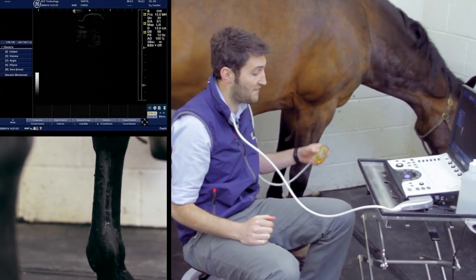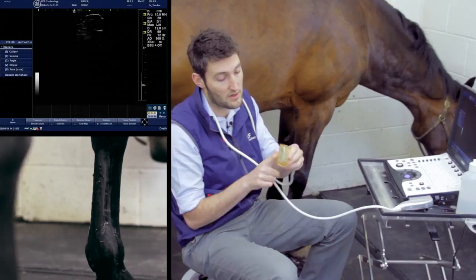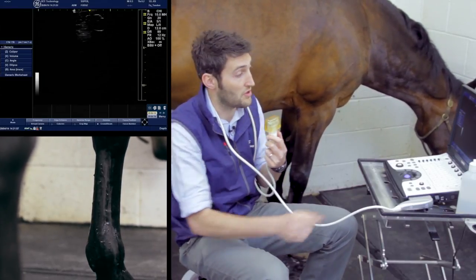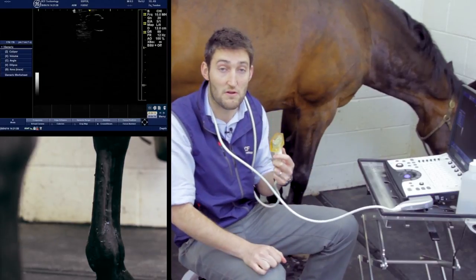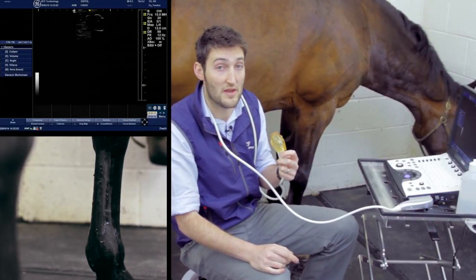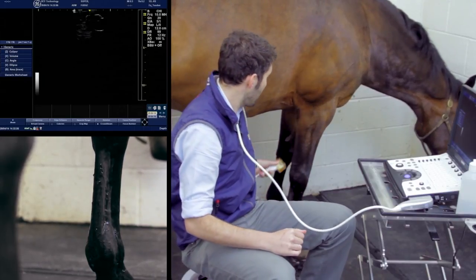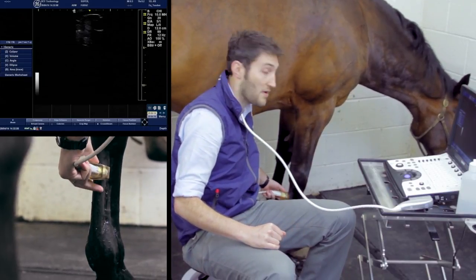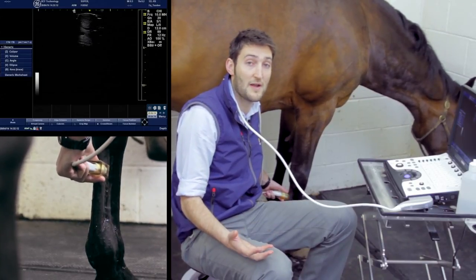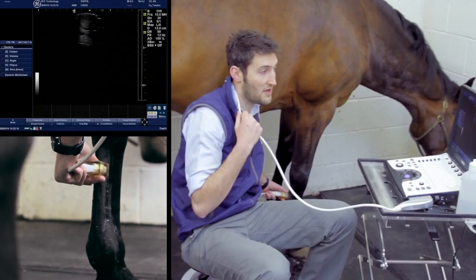The probe should have a marker on one side. By convention, that marker — which corresponds to the marker on the left-hand side of the ultrasound screen — will be on the lateral side of the leg. So in this instance, the marker will be pointing sideways. By convention, we'll tend to start scanning with the probe in transverse section.